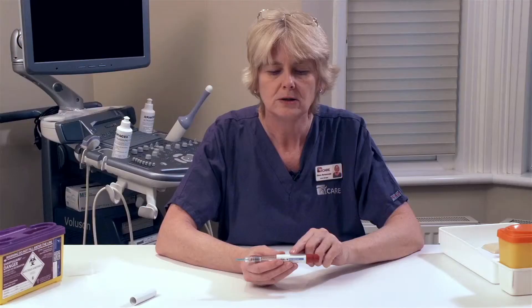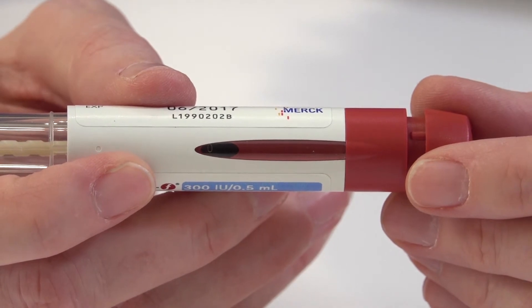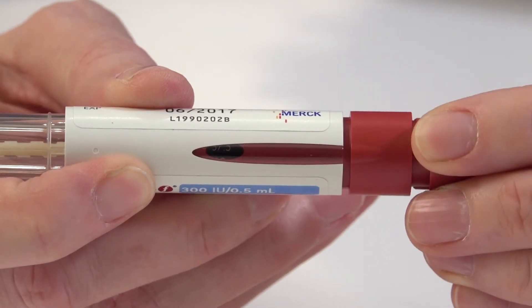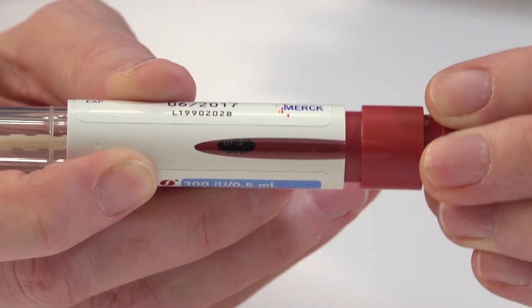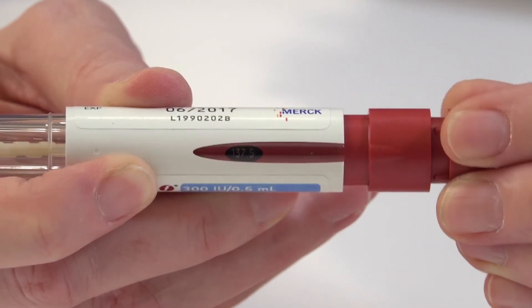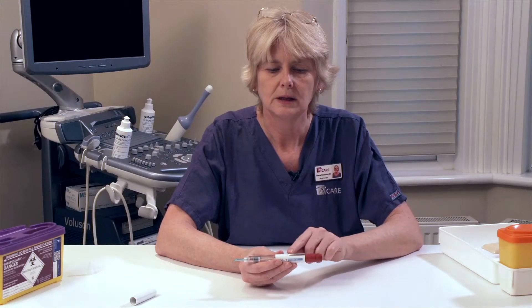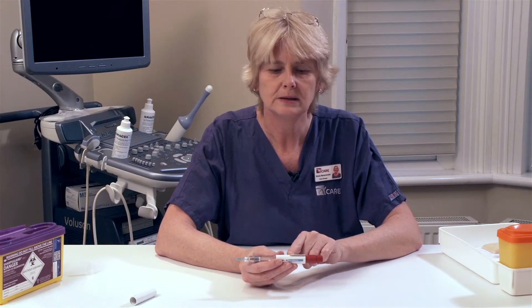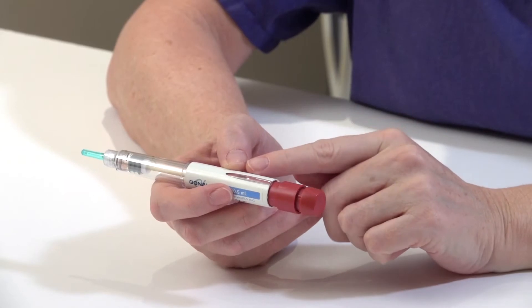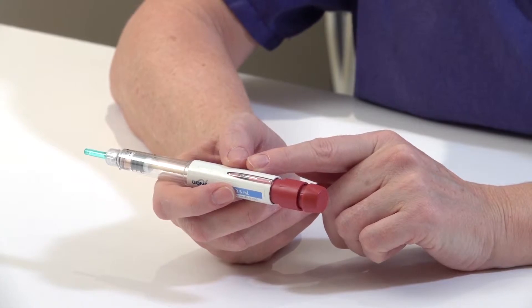The next step is to set the dose in the window on the pen. To set the dose, turn the dial at the end of the pen until the desired number appears in the window. You can go backwards and forwards if you go past the number, until this number correlates with the dose that has been prescribed for you. Once you have the required dose in the window, you are now ready to administer your medication.